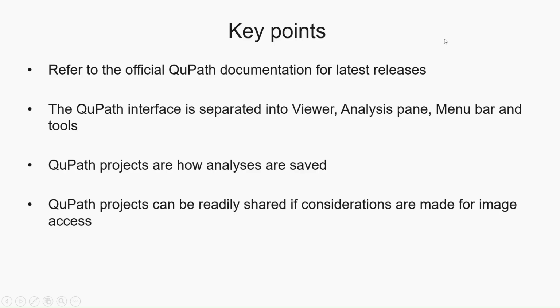In the next module, we'll be going over some digital image basics and understanding what is the data that is stored in an image file.